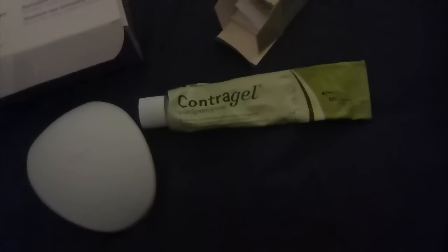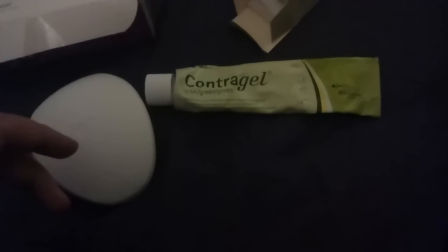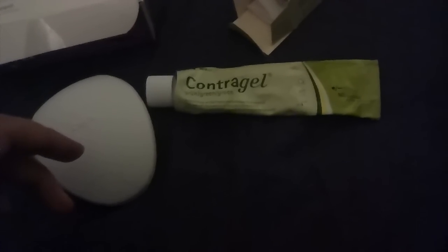Everything in life is a compromise. For me and my partner, sometimes we use this and sometimes we use condoms — it gives him a break from condoms, and not using this gives me a break from altering the pH in my vagina. As a young woman I think this is brilliant, and I wish I'd been told about it by my GP, who did nothing but push the pill or the implant, which don't work for me.